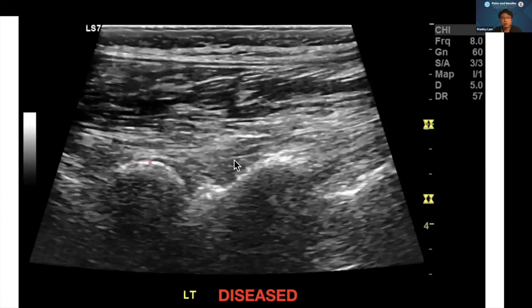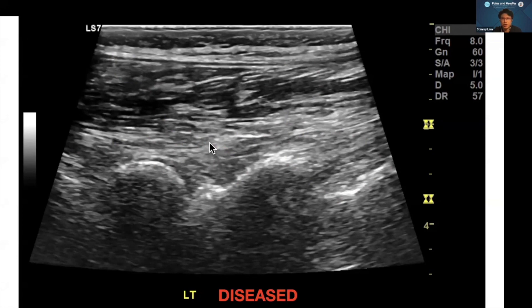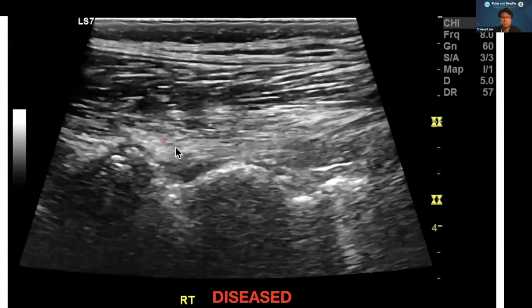On the longitudinal view you can see the facets of L3-4, L4-5, and L5-S1, with the multifidus and longissimus, and the thoracolumbar fascia on top. Notice the derangement in the striated pattern of this multifidus and increasing hyperechogenicity. The left side is not too bad, but the right side is much worse. There is also a very osteoarthritic pattern at L3-4 and L4-5.